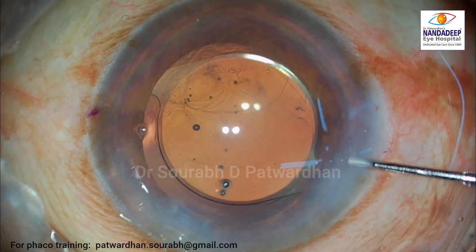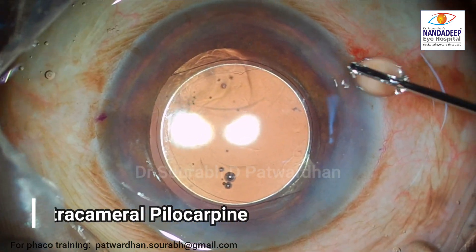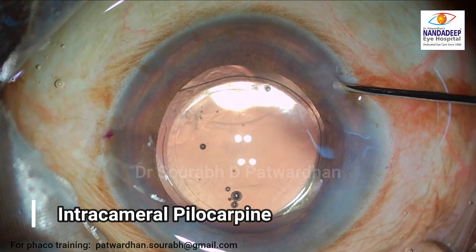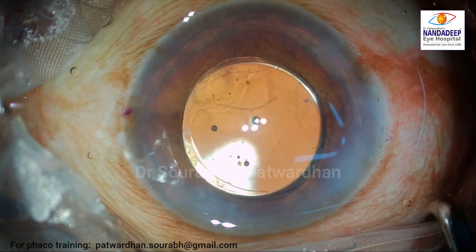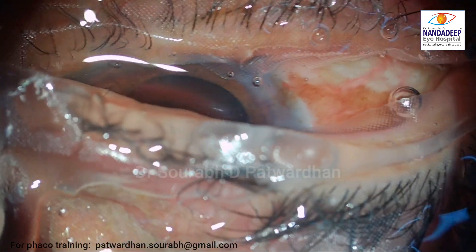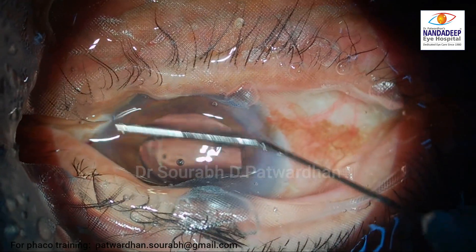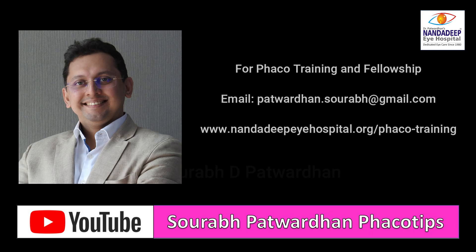The IOL is in the bag and well settled. I am injecting a little bit of pilocarpine to constrict the pupil to avoid any optic capture — and that's the end of the surgery. Make sure after removal of the speculum that there is no anterior chamber collapse, as this is very important in cases of posterior capsule rent — we don't want AC collapse and IOL movement.